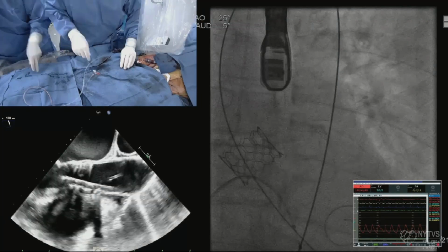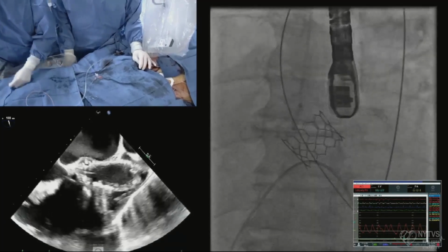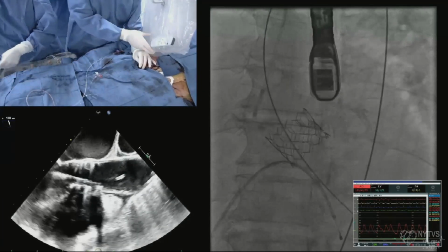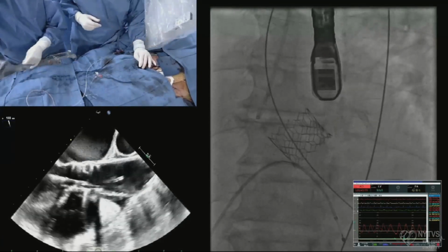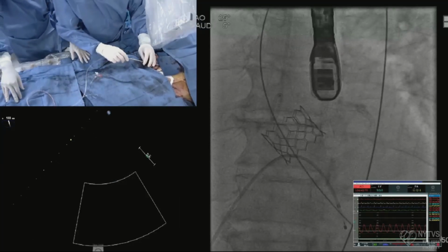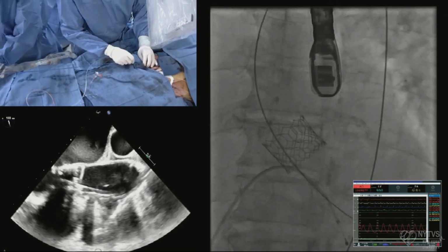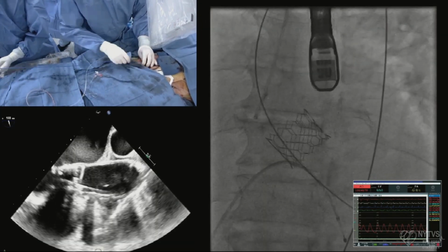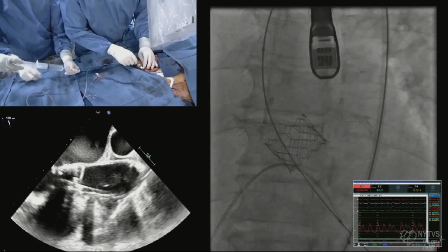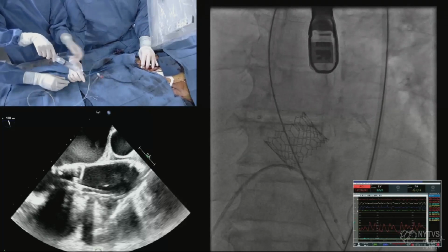Yeah, a little aggressive. We're a little bit more aggressive. There's a risk of rupture, obviously, but we don't see on the pre-TAVR CT any calcified anatomy. So we're going to see how it looks and behaves. But one thing is that if you don't do that with the leaflets thickened, you're going to underexpand the tall valve. And what happens is that you're going to have to post-dilate, but if you implant the valve too high, you won't be able to do that because you risk a pop-out. So we like to precondition the first valve as much as possible.